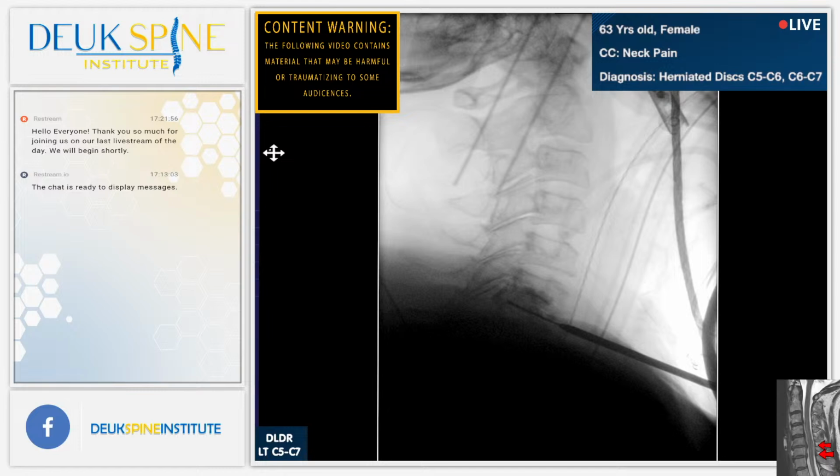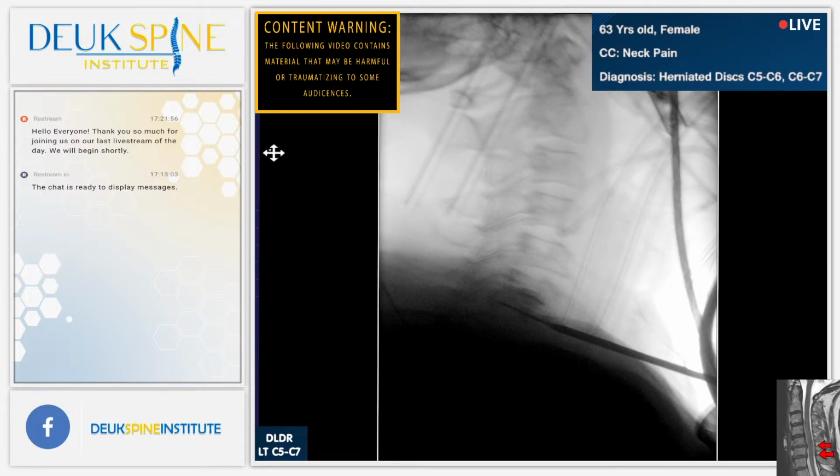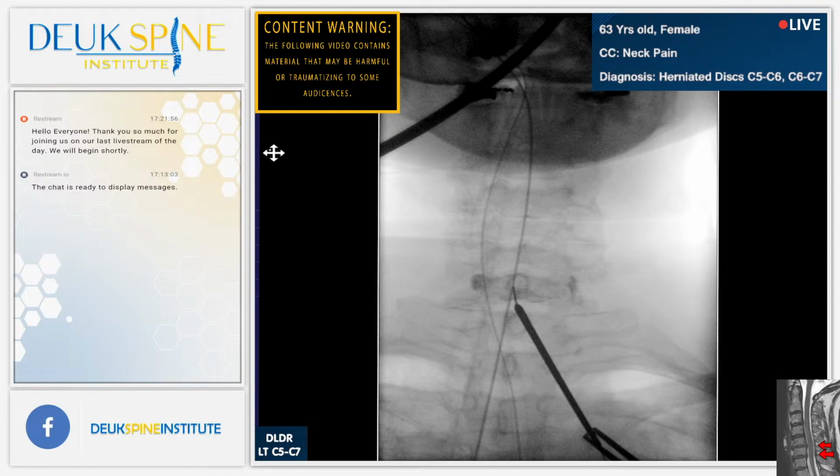We're doing this surgery for a few reasons. Number one, the herniations are causing symptoms like neck pain. Also, radiculopathy, which is dysfunction of the nerve. That's very nice. Look at the dye there off to the sides. Jordan will show you the dye has leaked out of the disc. It's extravasated out by the nerve root on both sides, surrounding the nerve root and the herniation.